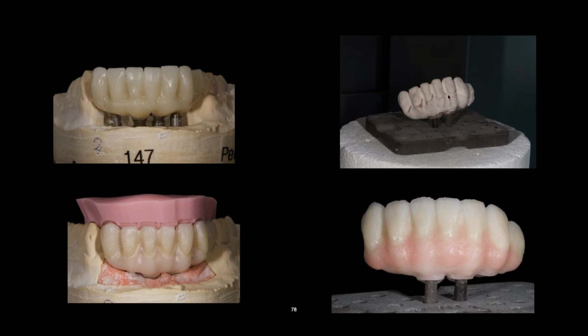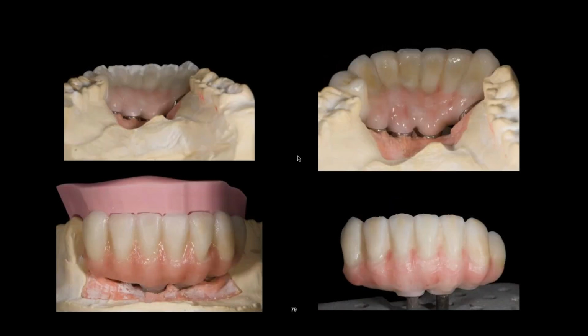And so we take this and I fire the liner material, and then I go ahead and build up and start doing the gum. And then this is a first bake. And then I do a second bake. You can see up here with the incisal, and here we characterize the gum again to make it look like real tissue.